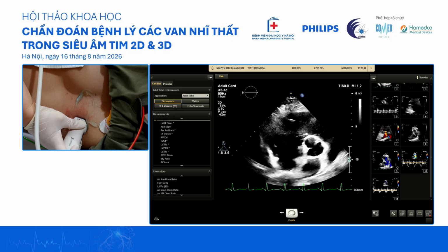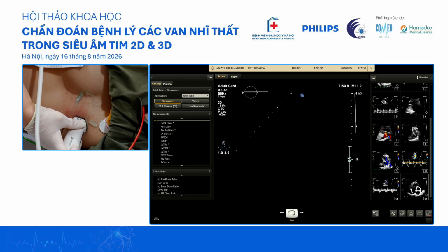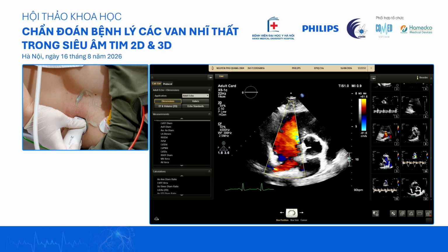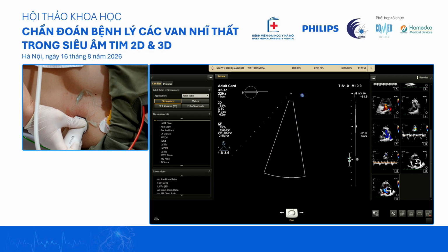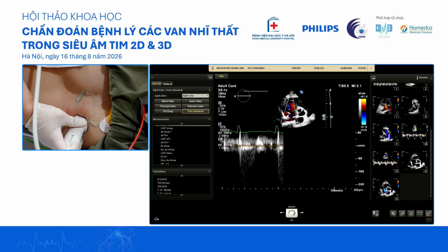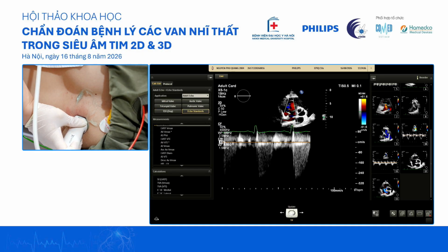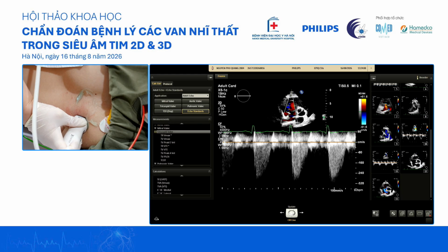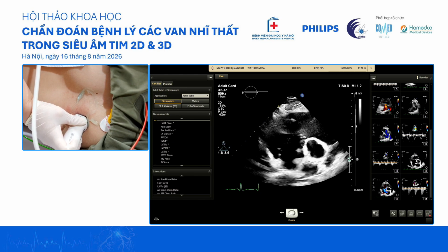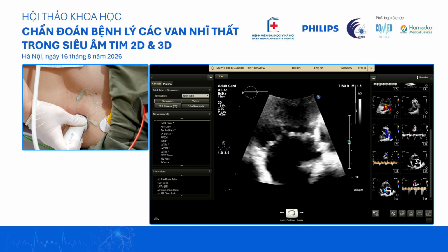And then as always, because we need to do multi-plane, we will take a look at the tricuspid valve also from the short axis. Vì chúng ta cần phải đánh giá ở nhiều mặt phẳng khác nhau nên chúng ta đã đánh giá mặt phẳng van ba lá ở mặt cắt trục ngắn. You can see that the TR velocity here is actually a little bit higher in the short axis as compared to the RV inflow view.